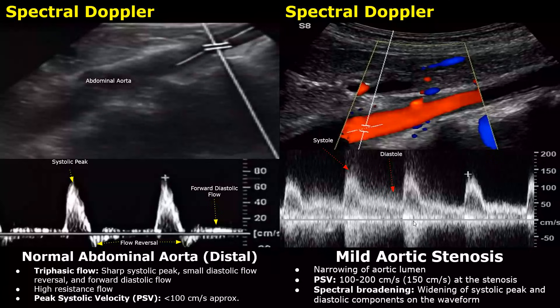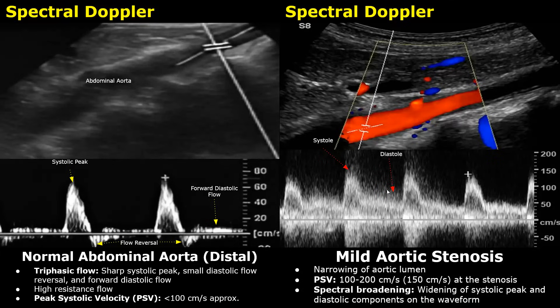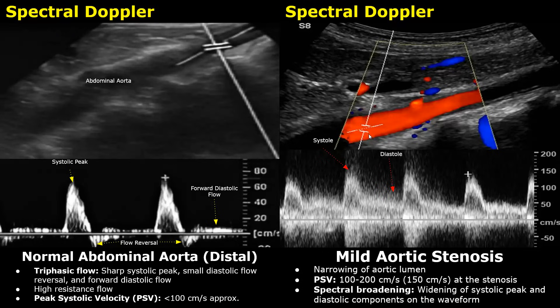Now we will look at abnormal spectral Doppler studies regarding the abdominal aorta. Stenosis is the narrowing of the artery due to a thrombus or plaque. Normal peak systolic velocity is usually less than 100 cm per second, though in some patients it may be 110 or 120 cm per second. In mild aortic stenosis, the PSV is between 100 and 200 cm per second. You also notice that the waveform is wider and appears more rough compared to the normal waveform.